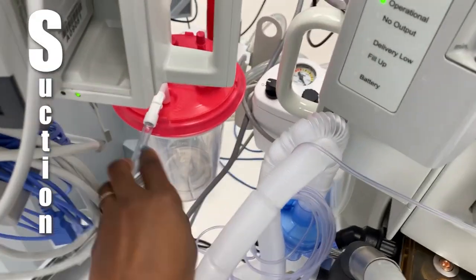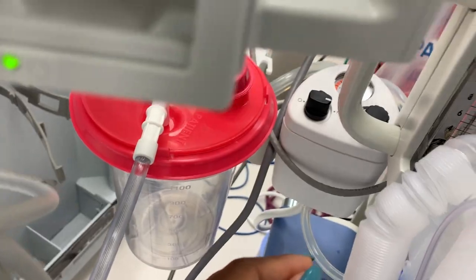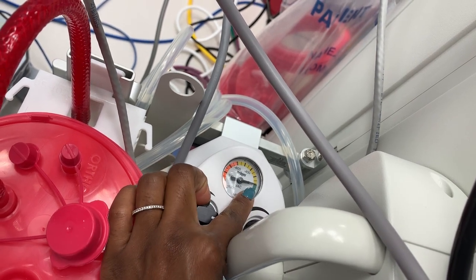So this is a suction canister. We have it set up and ready to go on an anesthesia machine. You want to make sure it's turned on and it's at its full capacity for suction. You can turn this dial all the way. Make sure your suction is in the green.